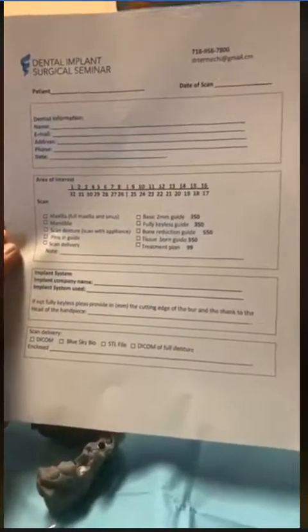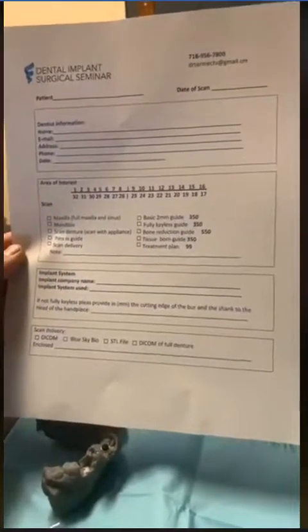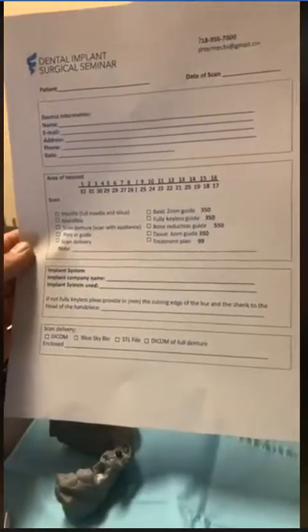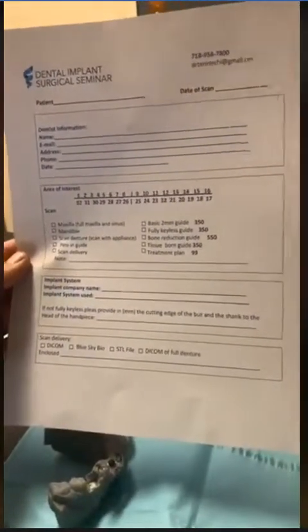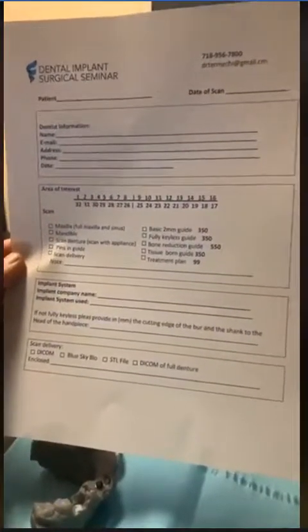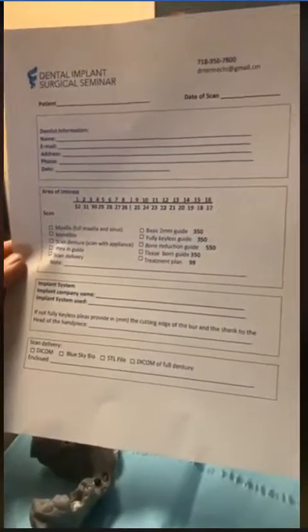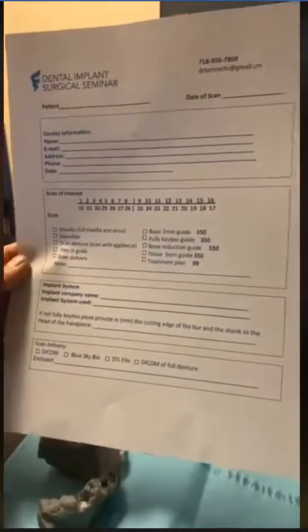You could send a treatment plan very vaguely. You could go ahead and tell us which site you're putting an implant in, what kind of restoration you want to do, and what kind of guide you're looking for. It's a basic guide, which is a 2mm guide, or whether you want to have a fully keyless. And I definitely strongly suggest, and as I said, I don't care what implant system you use, it behooves you to get yourself this Blue Sky Bio kit, so at least you could go through the entire surgery guided, except when you're ready to put an implant in there, okay?